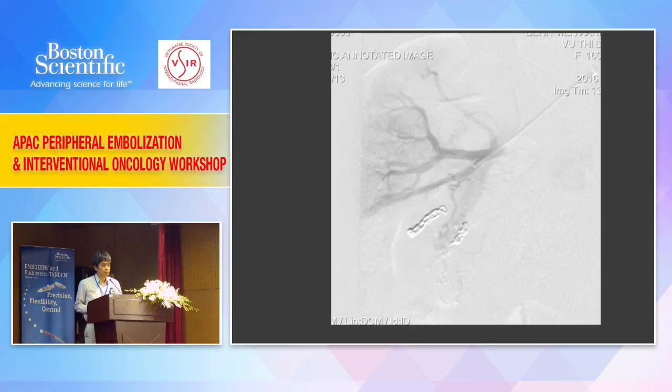But because we cannot control the fistula, we have to choose the coil to occlude the pedicle of the malformation. And happily, even with the coil in the pedicle of the malformation, in the future we hope that there's no collateral to come into the malformation again. So even though it's an arteriovenous malformation with a fistula, only with the coil we can occlude the malformation definitively.